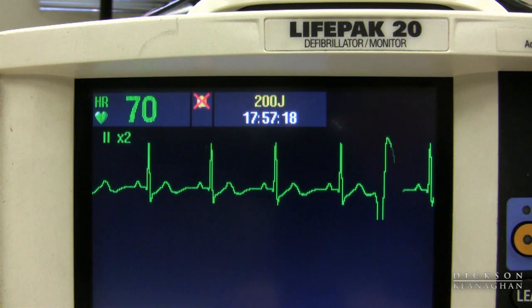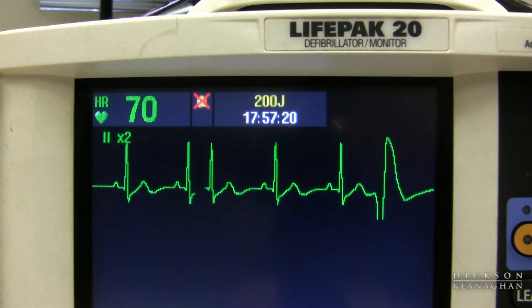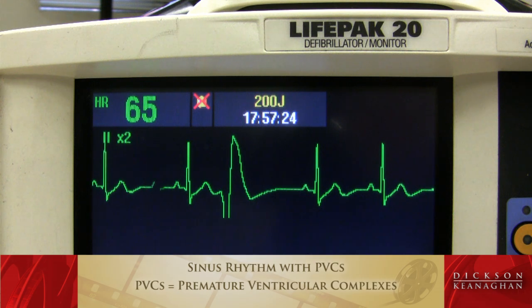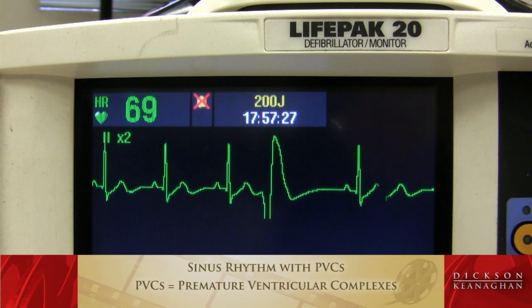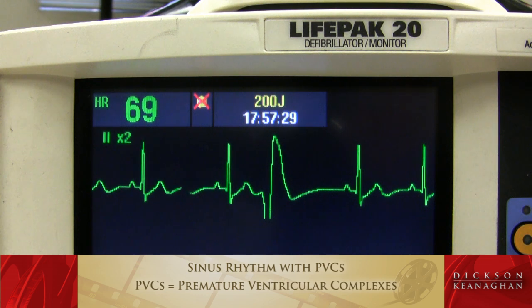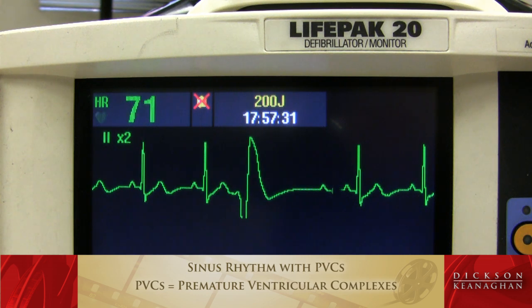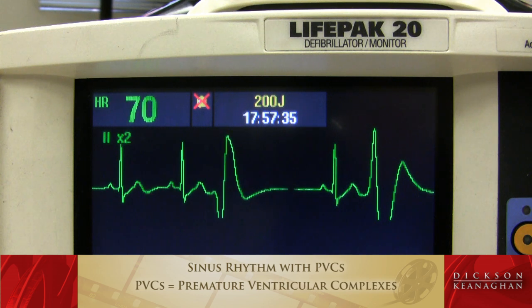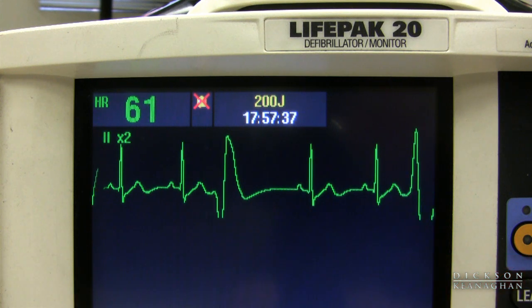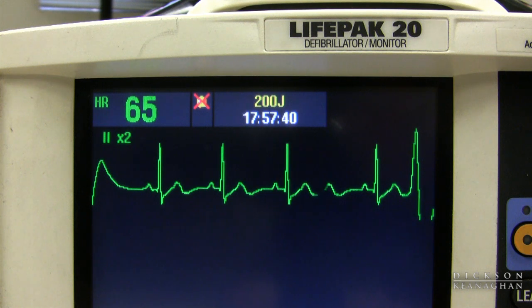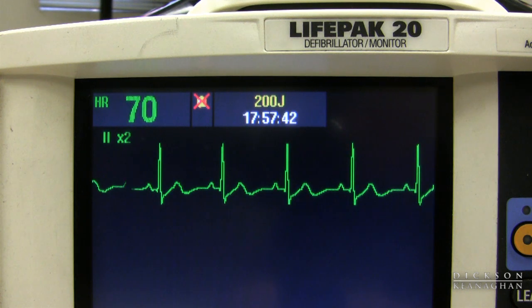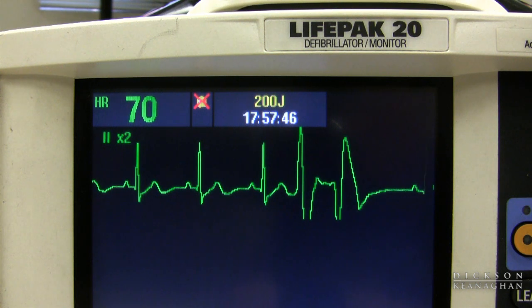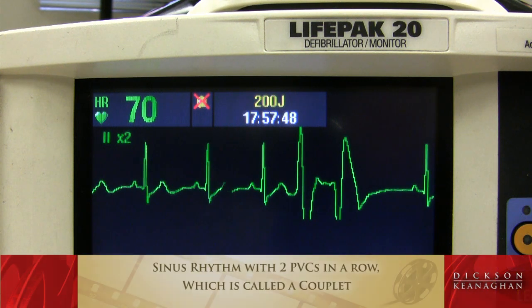Here's a sinus rhythm with PVCs — an ectopic originating in the ventricle. They could be unifocal PVCs, or if they look different, they could be called multifocal PVCs. Here is a sinus rhythm with two PVCs in a row, called a couplet.